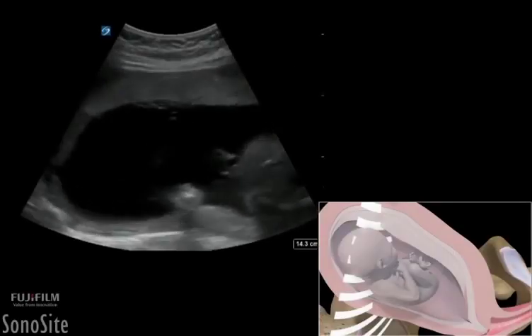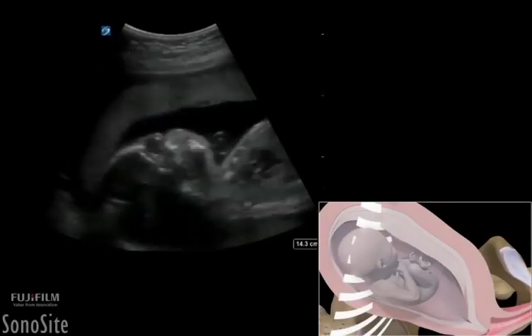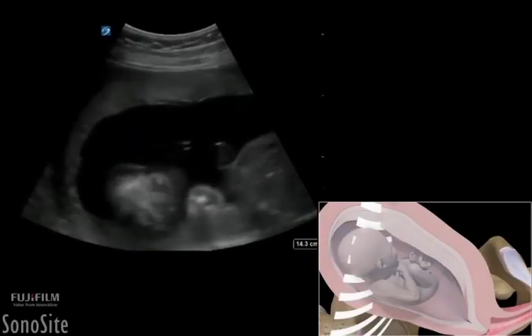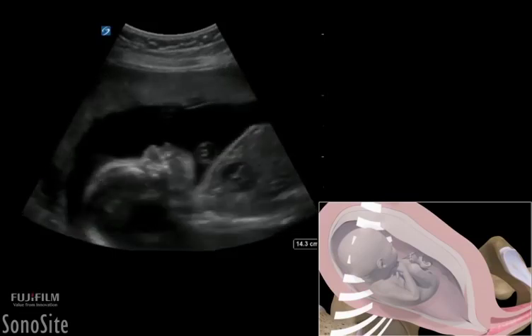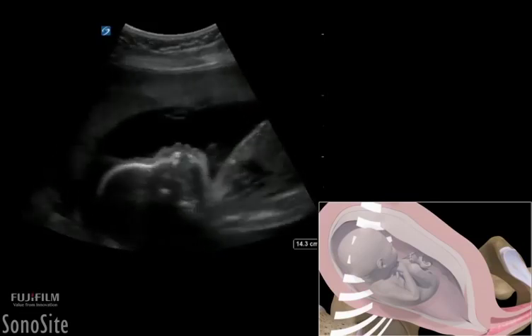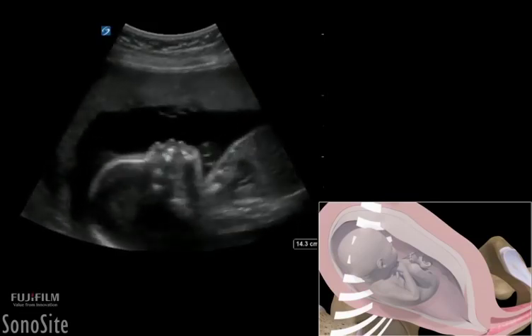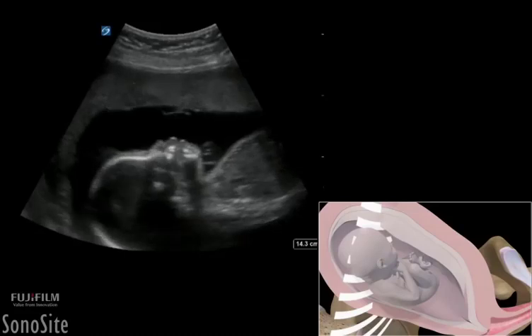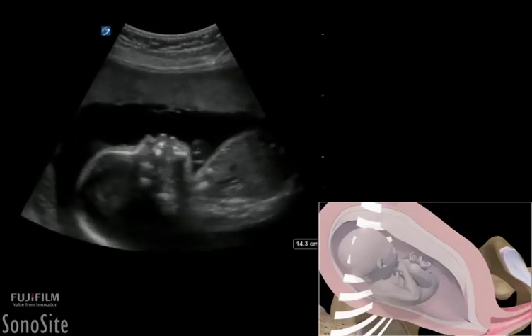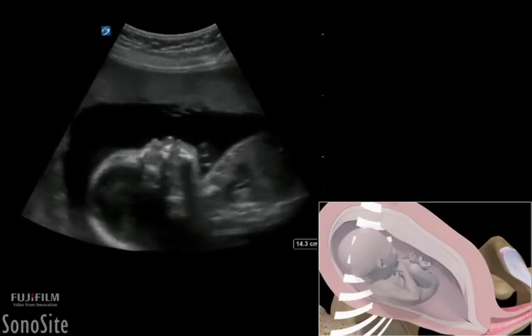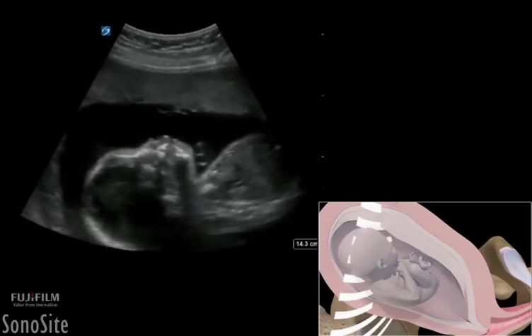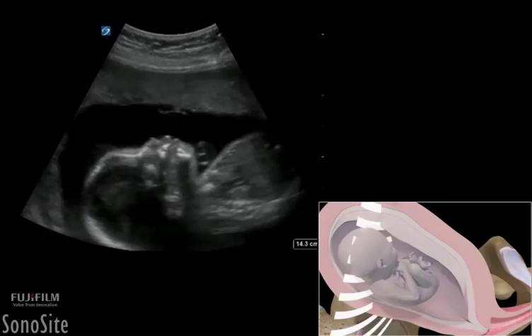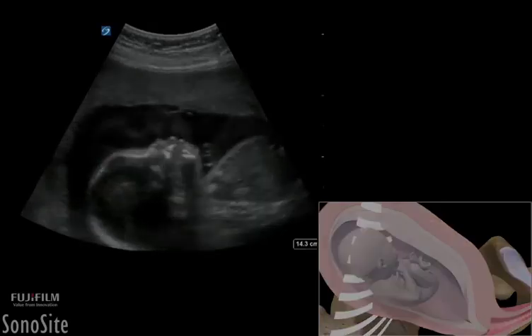A curved or phased array transducer with an OB exam type is used to perform a transabdominal examination of an intrauterine pregnancy to determine fetal weight and age by measuring biparietal diameter, head and abdominal circumference, and femur length.